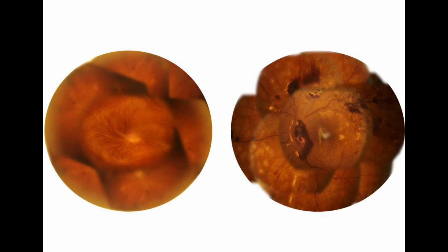This case presented two unique presentations of the fibrovascular membrane in a diabetic patient: the elevated stalk that was flower-looking, and the second scaffold of adherent membrane over the posterior pole. The highly vascular proliferation with stalk gave a unique appearance in this case.